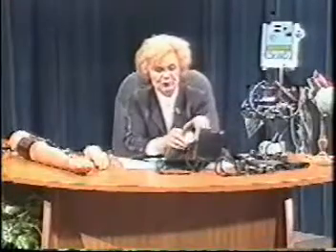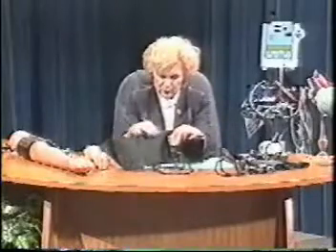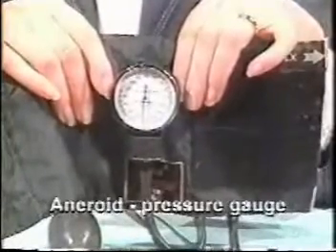The pressure gauge is the last piece that's a part of the sphygmomanometer. This one is called an aneroid type. It has a circular dial.